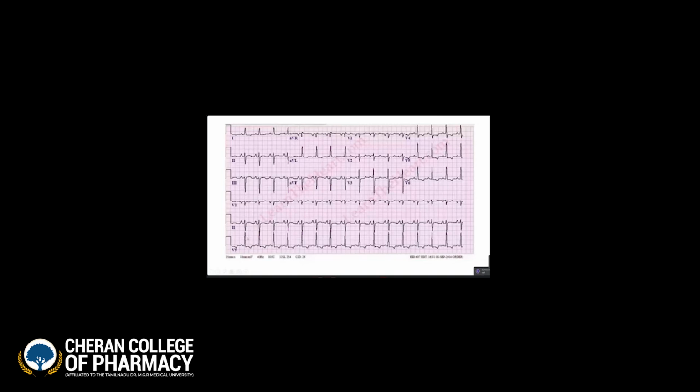This is the ECG, right? Can anyone say whether the rhythm is regular or irregular? Regular or irregular pattern? Regular. Okay. So how do we count the heart rate here? Can anyone count the heart rate for me?